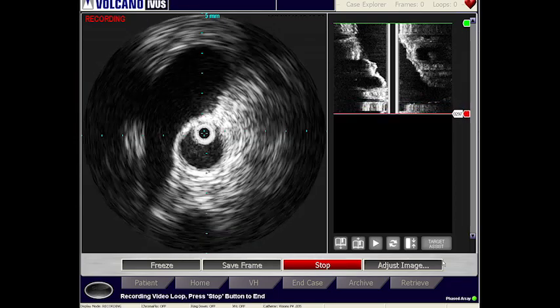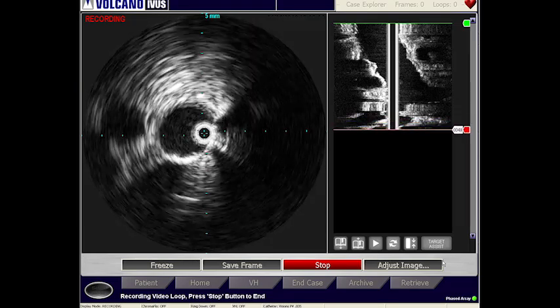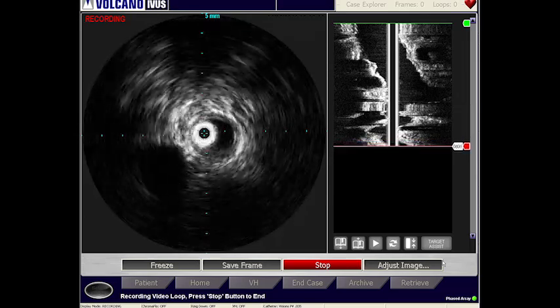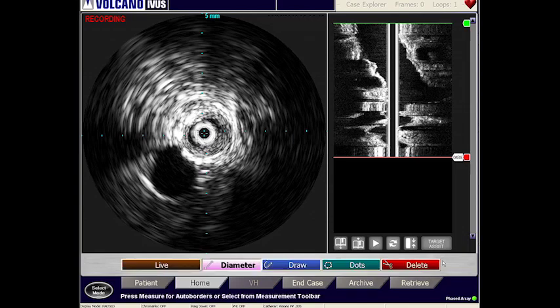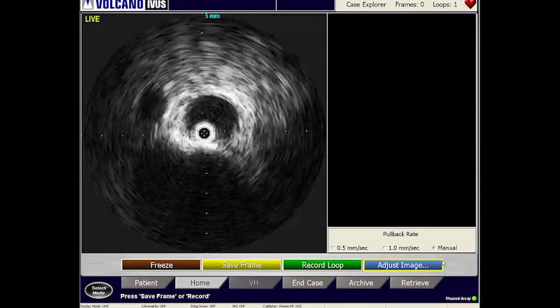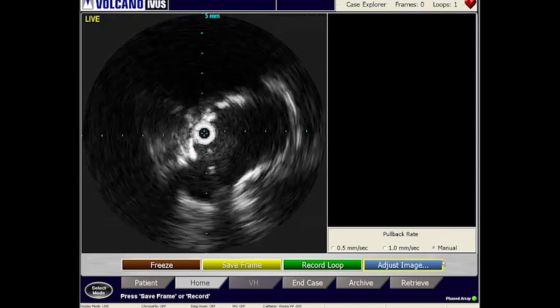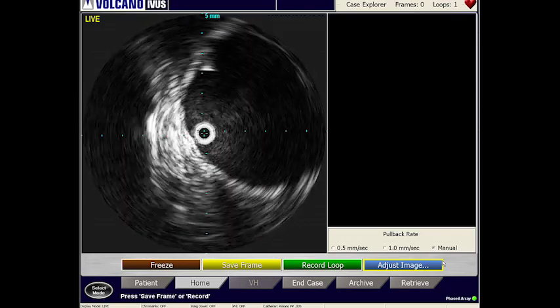With IVUS, heavy calcifications will appear bright white or hyperechoic, and will also present with acoustic shadowing, or an area through which sound waves fail to propagate. It is particularly important to note which renal artery is positioned lowest, because that will determine where the endograft is deployed. Using IVUS to visualize the aorta and its branches can also reveal the orientation of the vessels, such as whether the renal vein is anterior or posterior to the aorta.